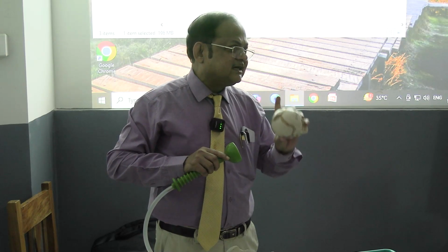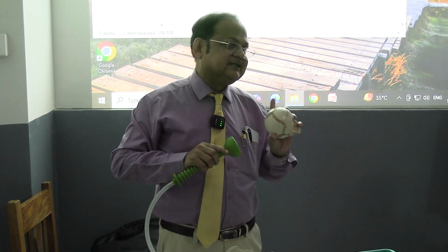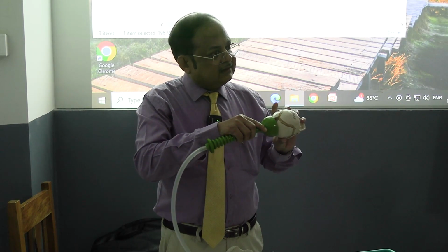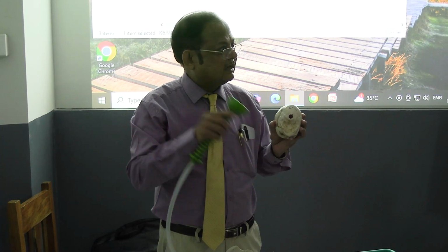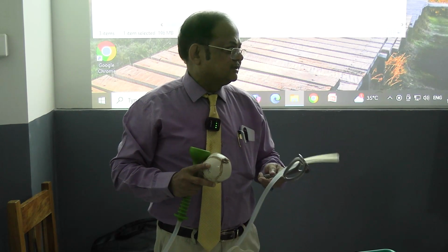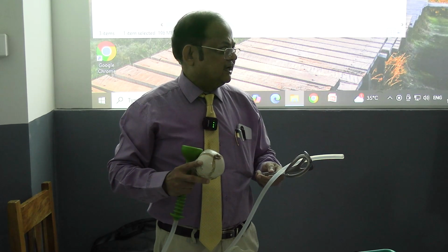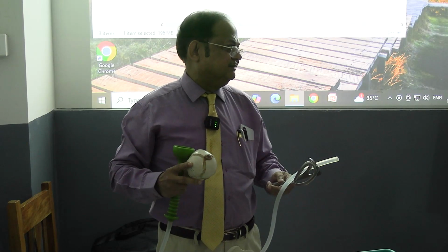This is a suction traction device by which the fetus is delivered. But there are some contraindications here, because you can apply it on the vertex, but cannot apply it in face presentation or to the after-coming head of the breech. But in case of forceps, it can be applied on the vertex, face presentation, and also the after-coming head of the breech.